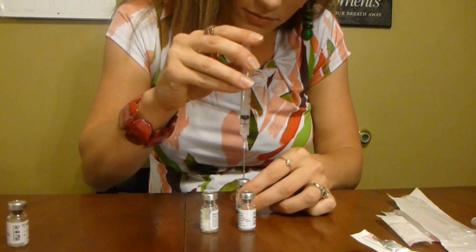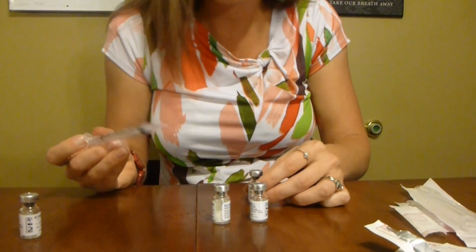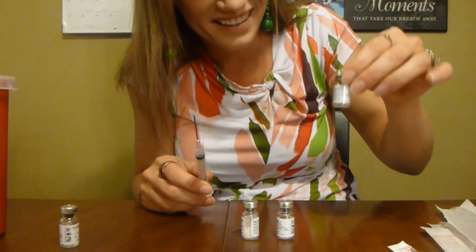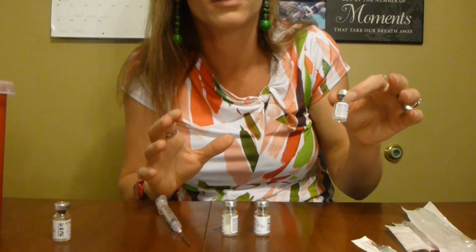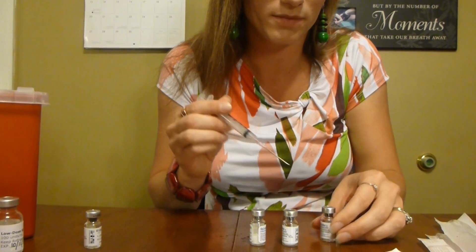I'm going to put that saline into the first FSH vial. The FSH is actually a crystallized solution — it's made of crystals — so it kind of dissolves in there. What I'm going to be doing is transferring from one vial to the next until I end up with the solution that has the FSH and the HCG mixed together.